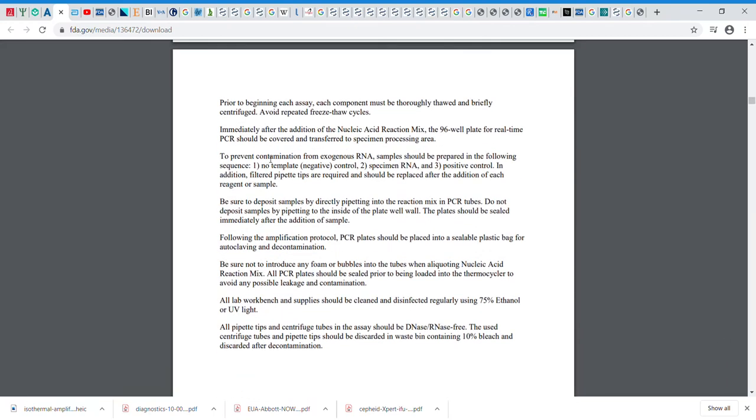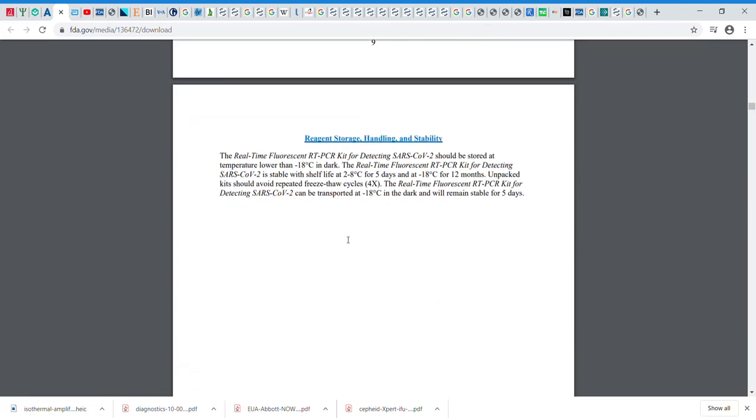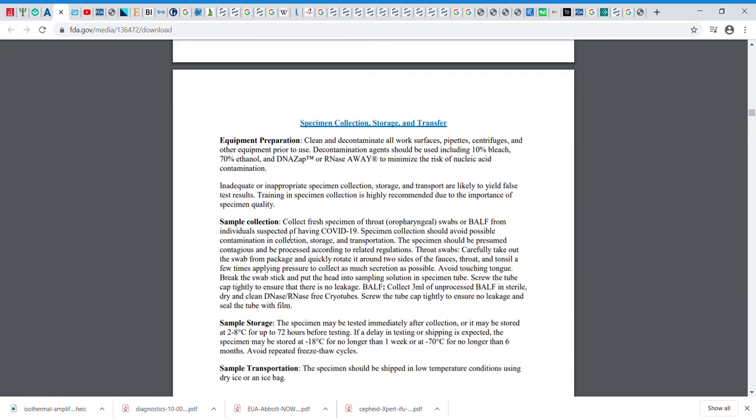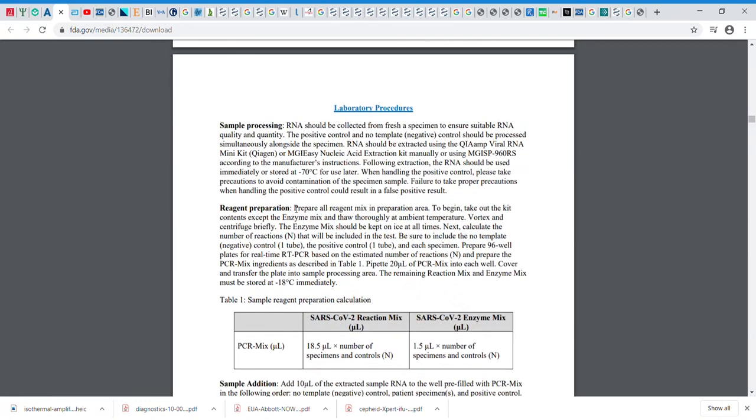They talk about how to prevent contaminants from exogenous RNA. There are a lot of quality control issues here. And if you look, the temperatures are very specific. You could transfer at negative 18 degrees in the dark. That's it. They tell you how to collect the samples. They tell you how to mix the reagents.